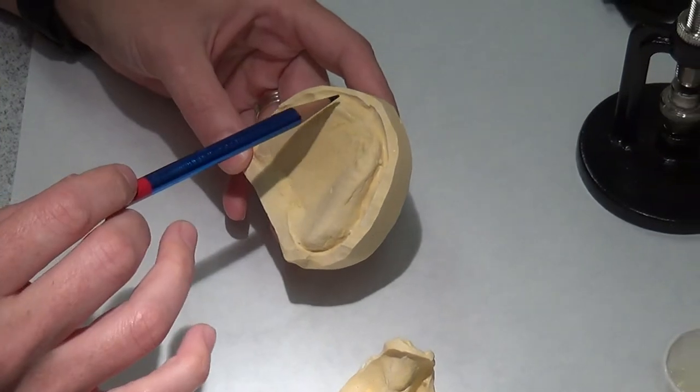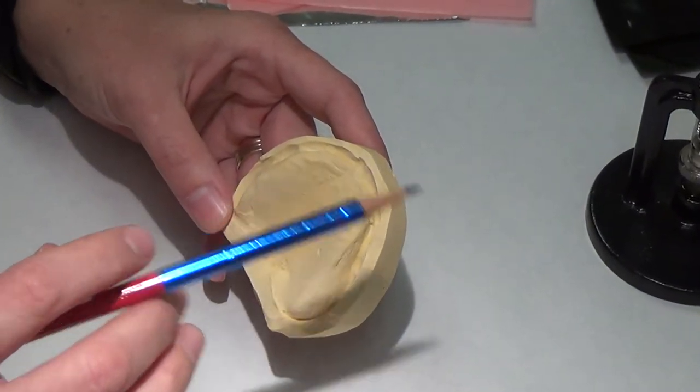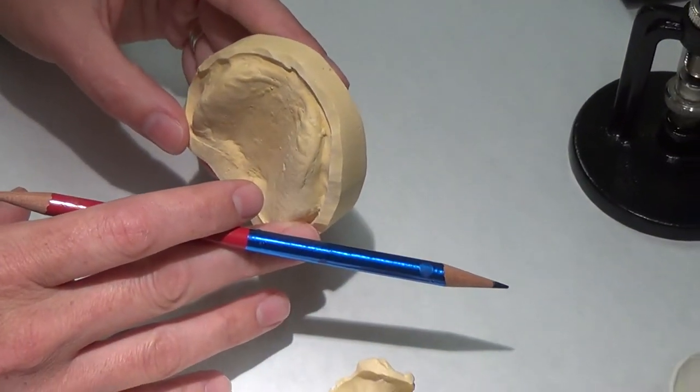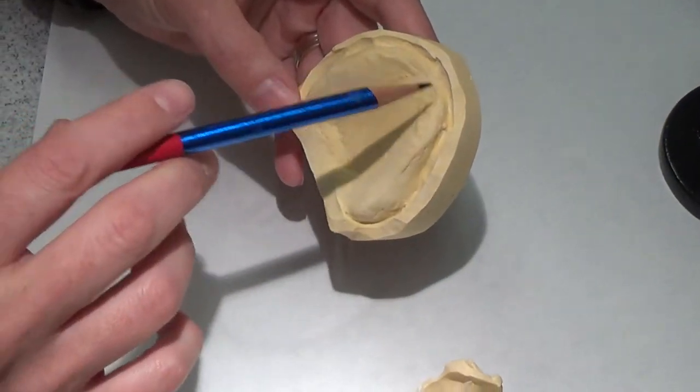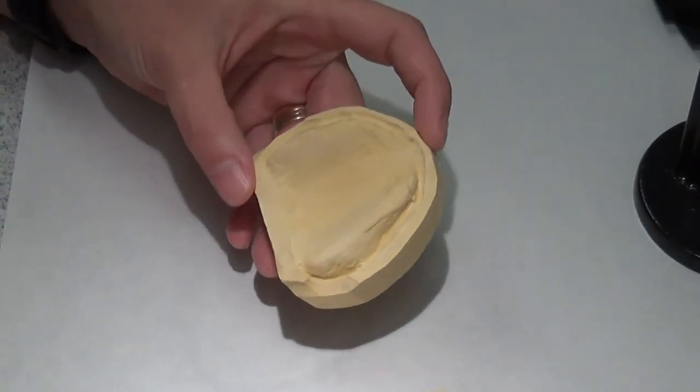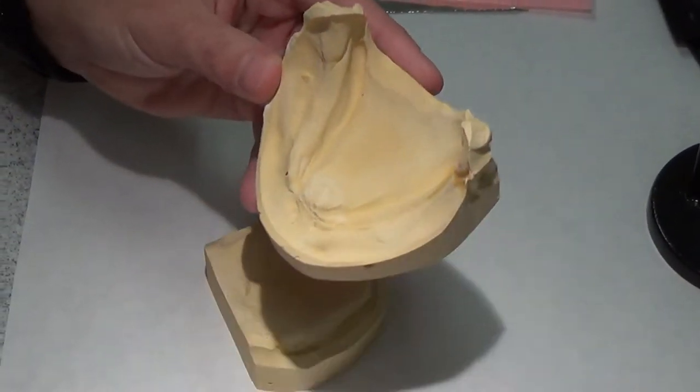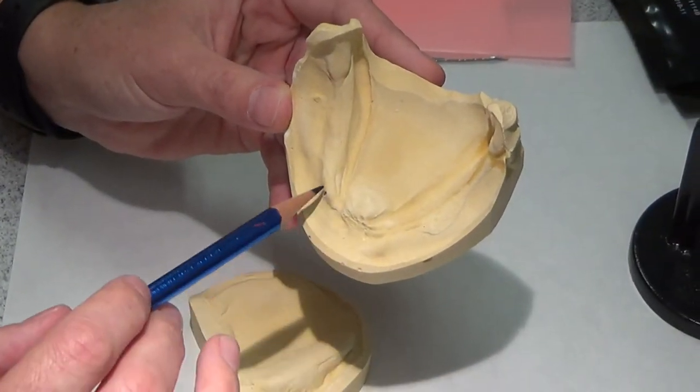She has a lot of resorption in this anterior pre-maxilla area. It's super flat, not a whole lot of attached tissue. On the mandible she actually has no attached tissue in this area right here. It's just mucosa continuous.